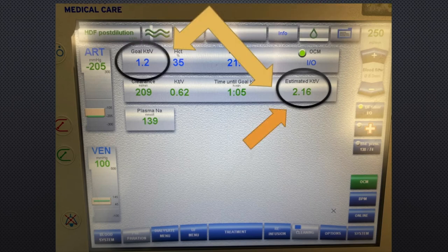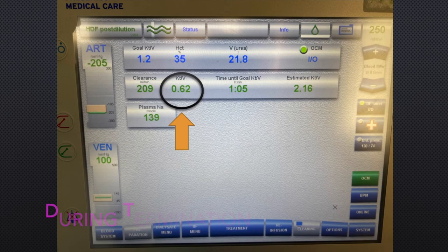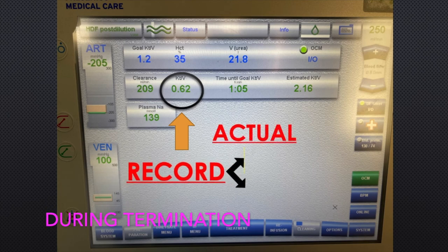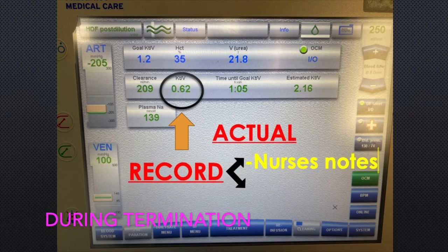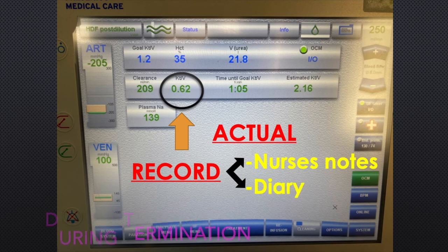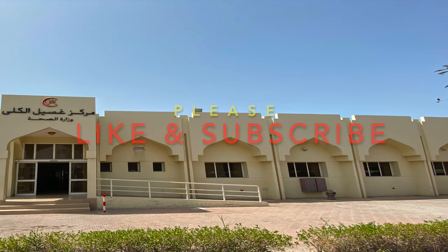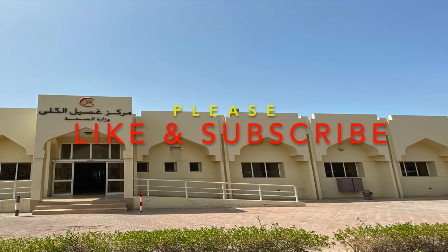Take note that this value should be more than 1.2, as set in our goal. Lastly, we have to record the actual KT/V along with the dialysate flow rate.